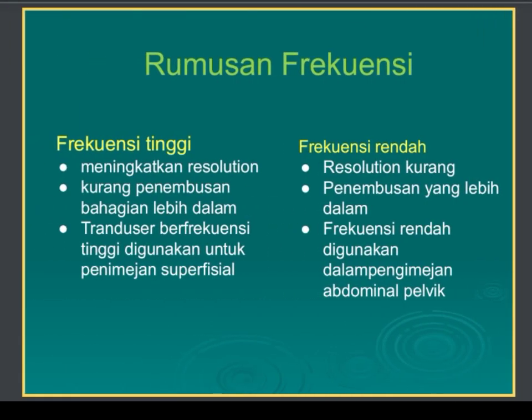Berikut adalah perbezaan gelombang bunyi berfrekuensi tinggi dan berfrekuensi rendah yang digunakan dalam ultrasound. Iaitu, untuk frekuensi tinggi, ia boleh meningkatkan resolution tetapi kurang penembusan bagi bahagian yang lebih dalam. Transducer menggunakan frekuensi tinggi digunakan dalam pengimejan superficial sahaja. Apabila kita menggunakan transducer berfrekuensi rendah, resolution akan berkurang tetapi penembusan adalah lebih dalam. Transducer berfrekuensi rendah ini biasa digunakan dalam pengimejan abdominal pelvic.